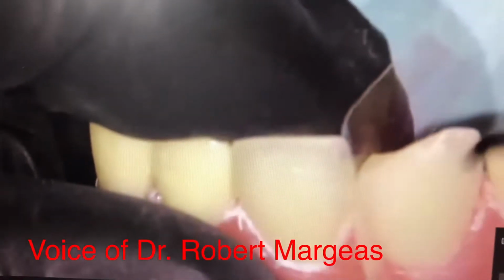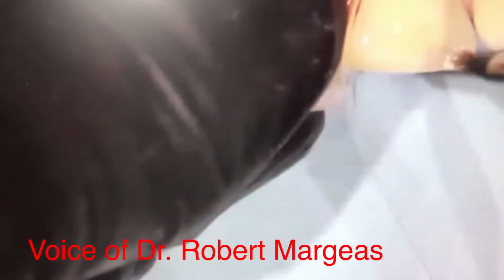You scrub it in. You can use the micro brush or you can use a mini brush. I actually prefer to use those micro brushes more than I do this brush. But I'm at my wife's dental office today and I wasn't as prepared. So I put that on there.